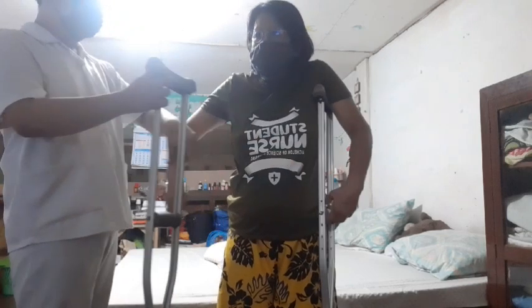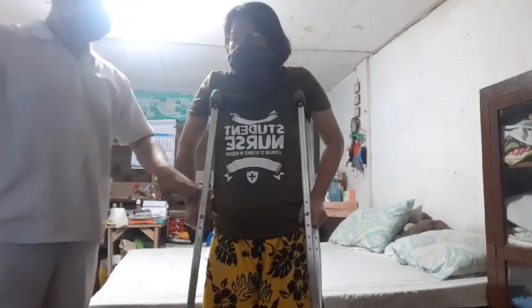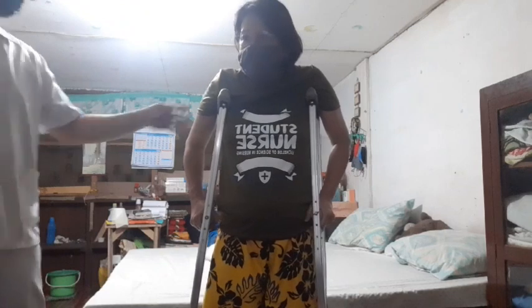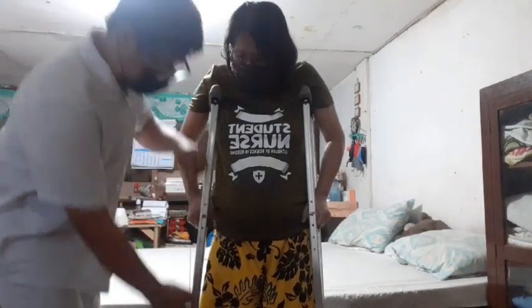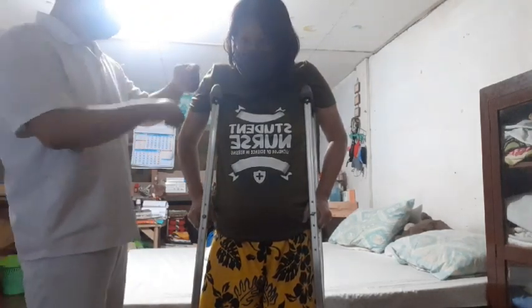When the patient is standing erect, place the patient against the wall with feet slightly apart and away from the wall. Mark 5 centimeters or 2 inches below the axilla as point B, and measure this point to the second mark, point A. This measurement is approximately the crutch length. Or determine the patient's height, then subtract 40 centimeters or 16 inches. This measurement is the appropriate crutch length.